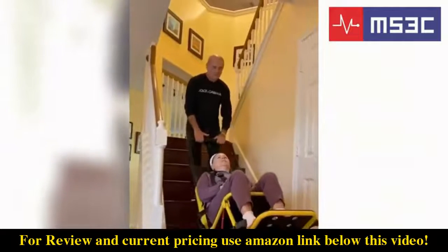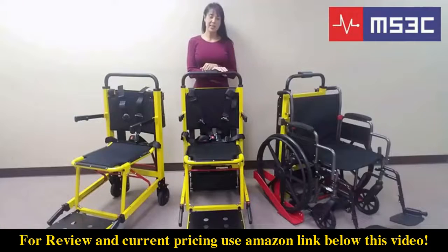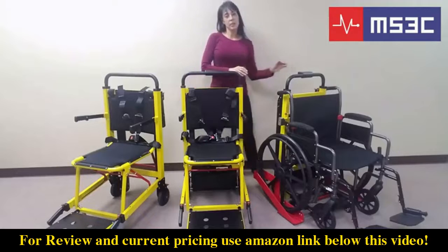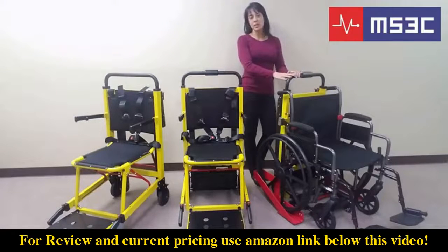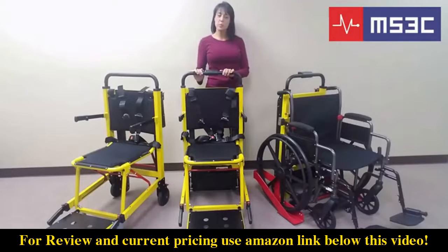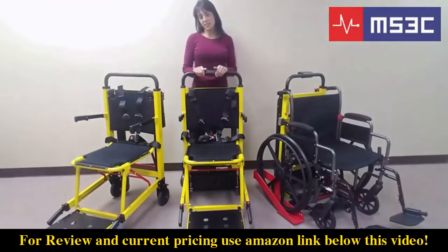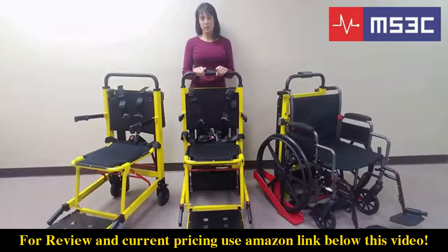When the chair reaches the landing, tilt the chair back to its upright position, making sure the front wheels are securely placed on the ground. MS-3C has several options for stair management. The MS-3C-300WC is designed to convert a wheelchair you may already own into a battery operated unit that can ascend and descend flights of stairs. The MS-3C-300TSB is perfect for home use or multi-story buildings. No matter what your stair assist need may be, MS-3C has the perfect option. MS-3C would like to thank you for your continued support.